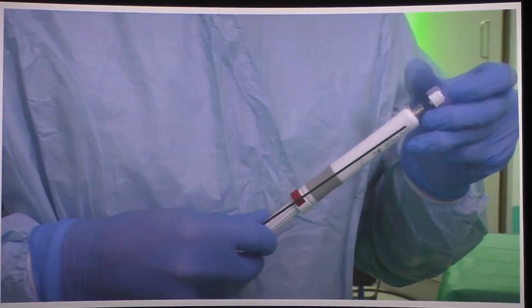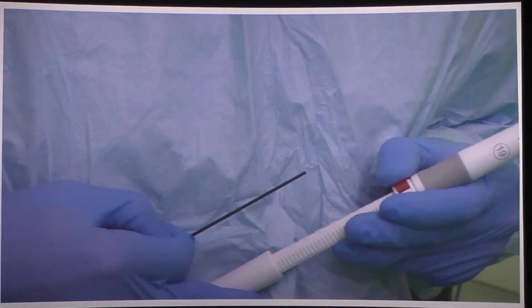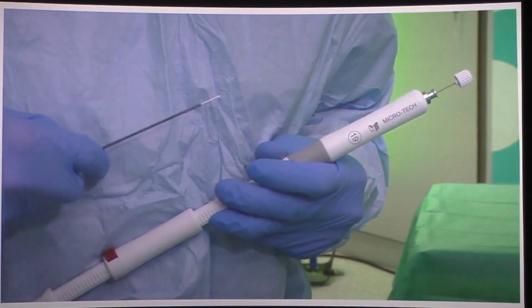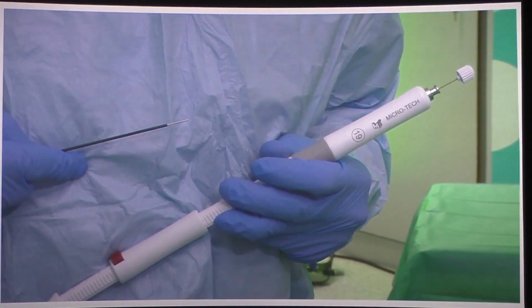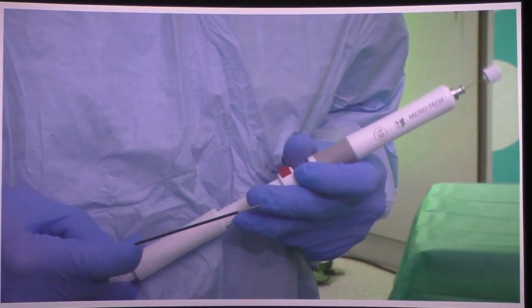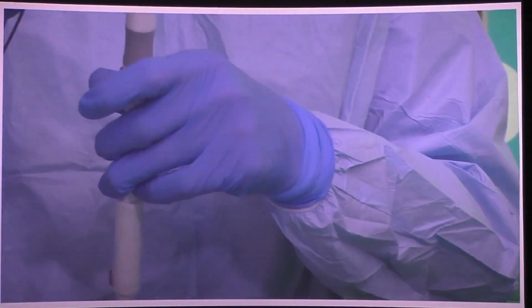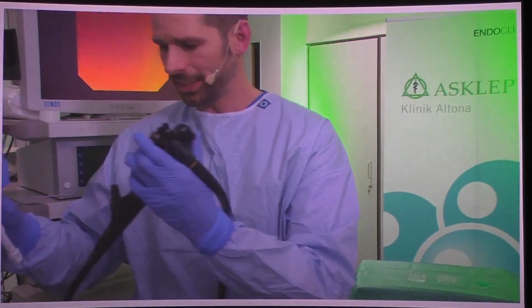The second feature is that the tip of the needle is a multiple tip needle. In this case we have 3 tips, 1 long one and 2 shorter ones. That's why it's called trident. And this ensures optimum penetration of tissue and good harvesting of material.